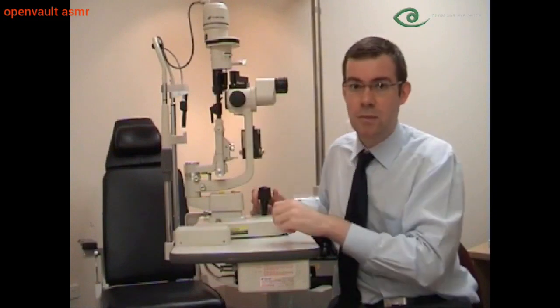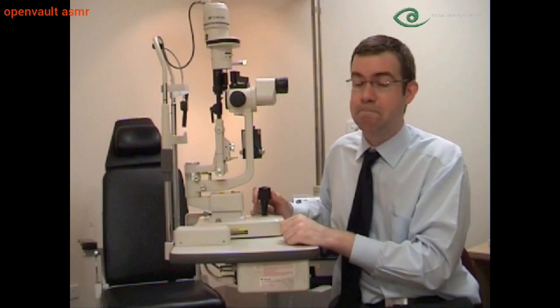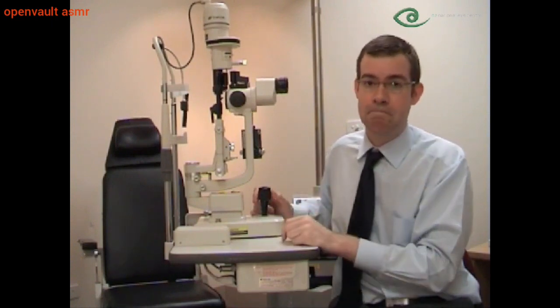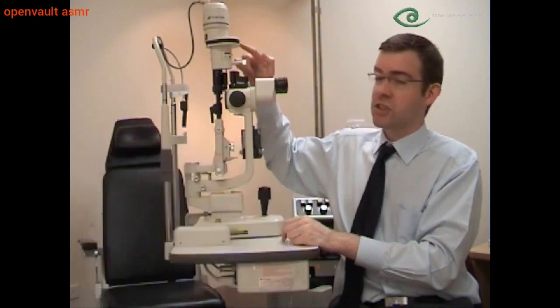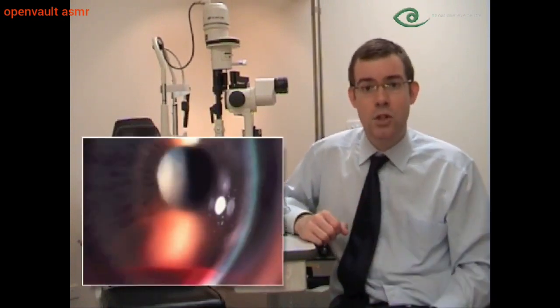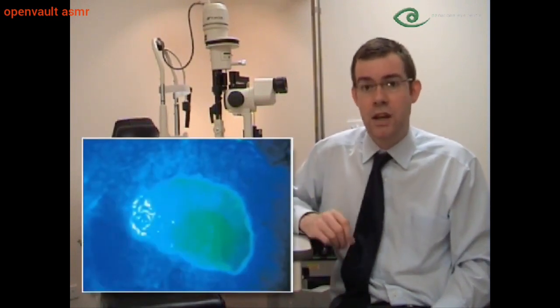The illumination system is a short focus projector which projects a slit of light onto the patient's eye. And we can adjust the height of that beam, the width, the orientation, the brightness and the colour. This dial adjusts the height of the beam, and on the scale we can read off the height. Why would we want to do that? Well, say the patient has a hyphema, or blood in the anterior chamber, we can measure the height of that hyphema. Or perhaps the patient has a corneal ulcer, we can measure the size of that corneal ulcer and follow them over time.